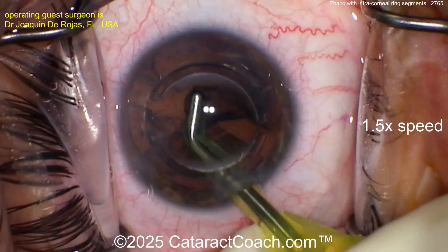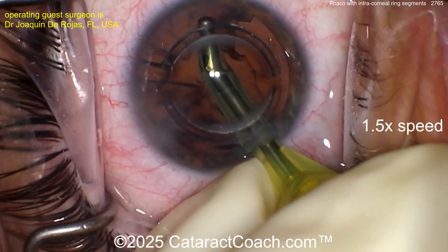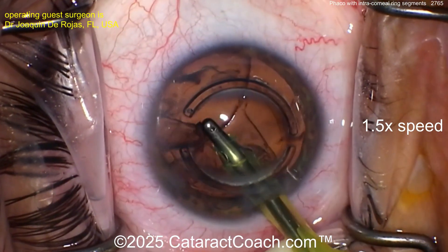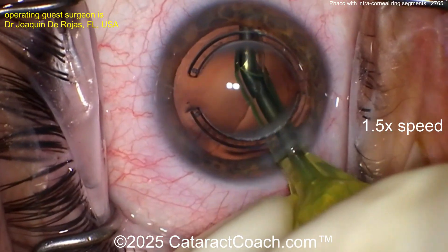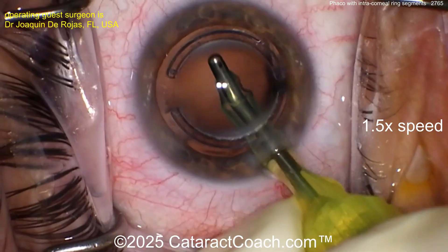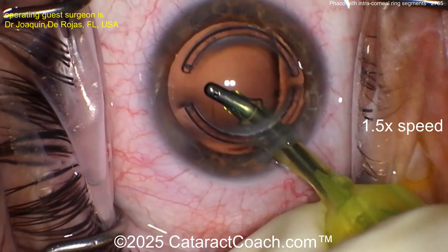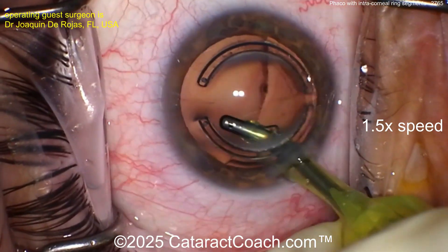Going over the eye, the probe is cleaning up the cortex. These intracorneal ring segments have been there for a long time — they're not exposed, well placed, no erosion — so just leave them in place. Measure the central corneal power where it's flattened and use that for your lens calculations. This patient is electing a multifocal lens, so aim for absolute plano, maybe even +0.25 — a slight bit of hyperopic — because with trifocal or bifocal lenses you need to hit that distance vision.